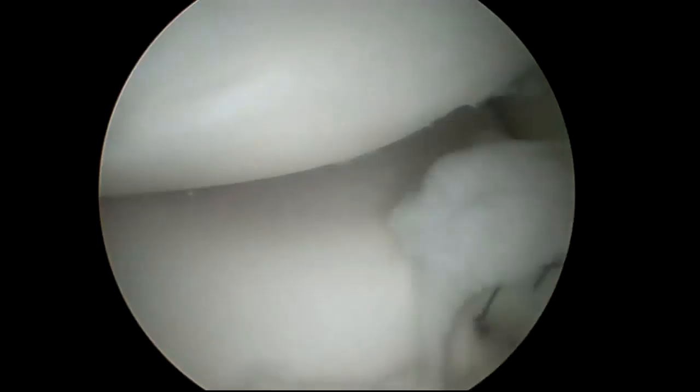We simply remove the tissue — very straightforward. As with all procedures, you probably want to have it done by somebody with expertise and experience in elbow arthroscopy to maximize results and minimize problems.